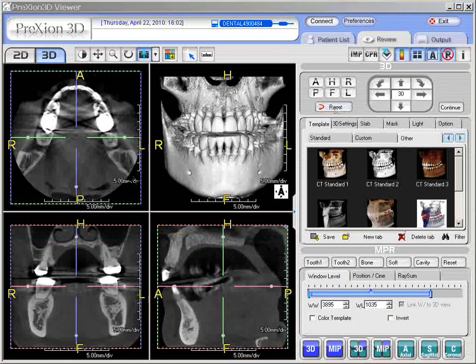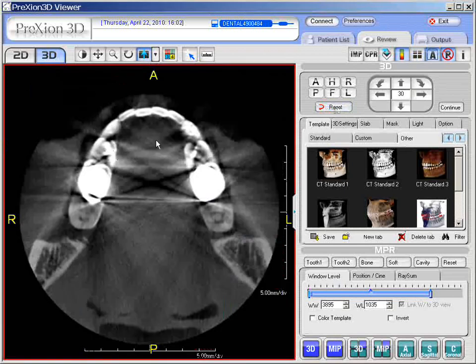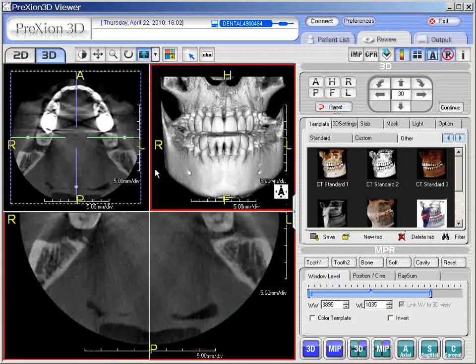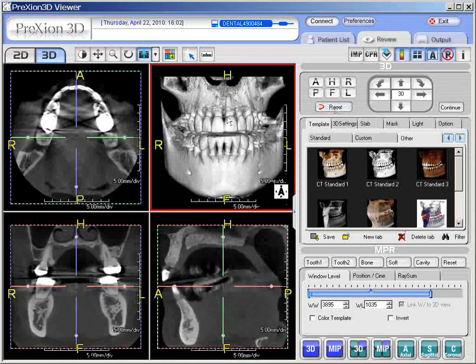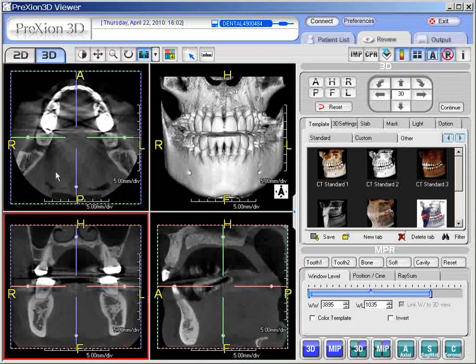If you choose the individual screens to magnify them by themselves, you can simply double click. It loads up — in this case — the axial screen. You can double left click again and it takes you back to the four-on-one format, this being the 3D image, axial, coronal, and sagittal.